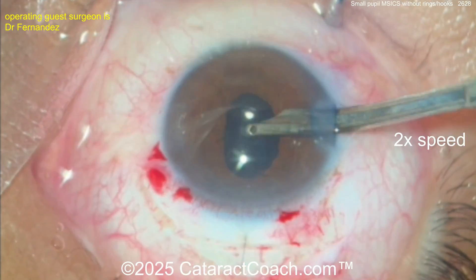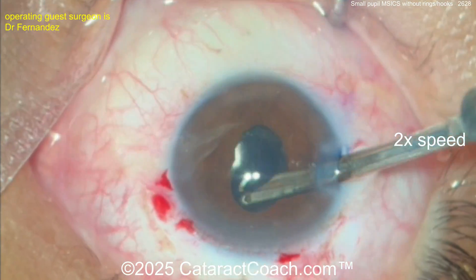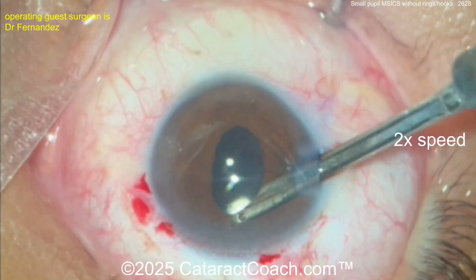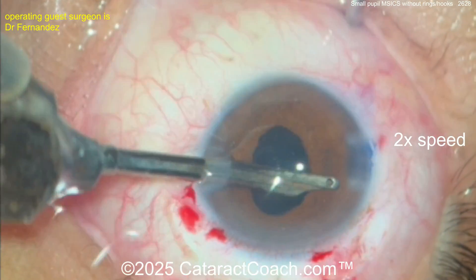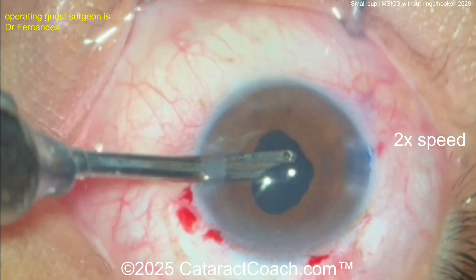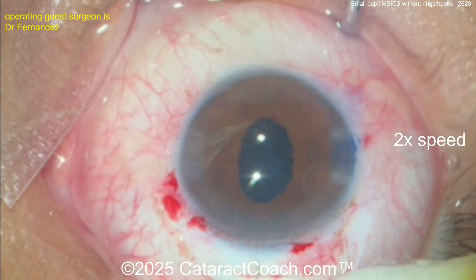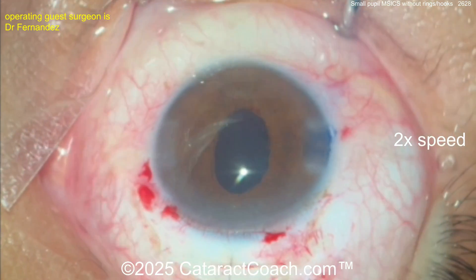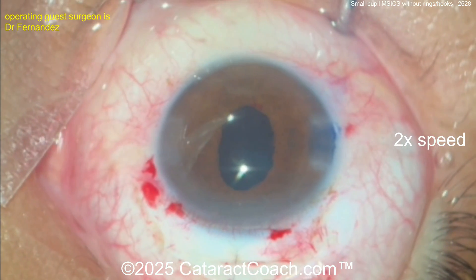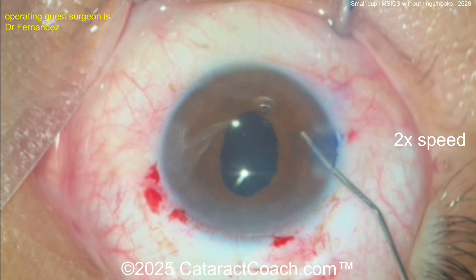Get it rotated, then take out the viscoelastic. You can see that even with the Simcoe cannula infusing fluid in the eye there is no leakage from that main incision — a very well-constructed wound. Clean out the viscoelastic, and at the end of the case just make sure to lift up the iris to check there's no surprise cortex you're going to see the next morning. The incision sealed up beautifully.